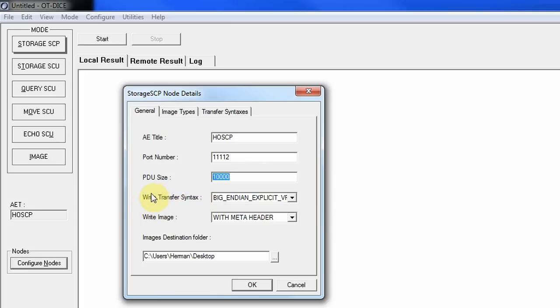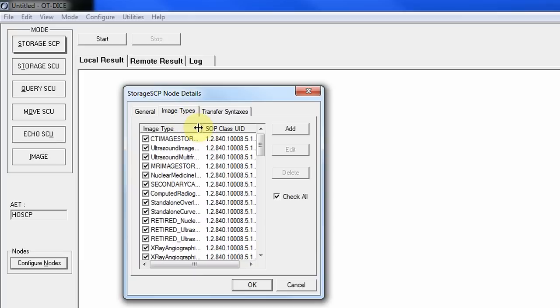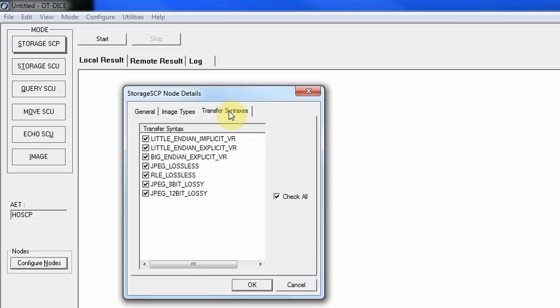We can also modify the write transfer syntax — for example, if an image arrives JPEG compressed, we can store it as an uncompressed file, or vice versa. We can also choose whether to write the image with or without the meta header, and specify the SOP subclasses and transfer syntaxes we want to receive.